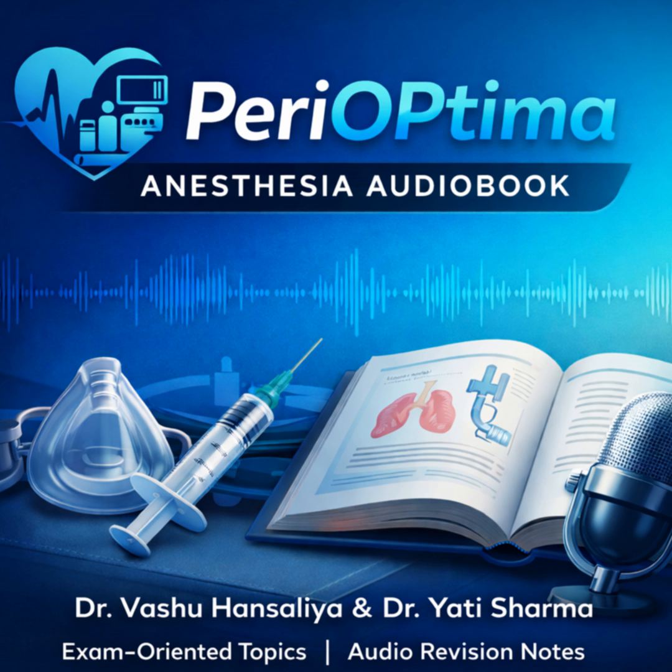Section 15. Intraoperative anesthetic goals. This is very high yield. What do I need to achieve? Preload is king. I can't stress this enough. ECMO pumps are centrifugal. They are preload dependent. If the patient gets dry from bleeding or vasodilation from anesthetic drugs, the vein collapses around the drainage cannula.